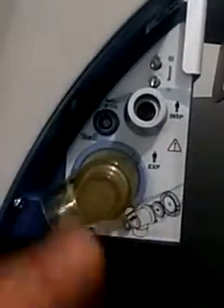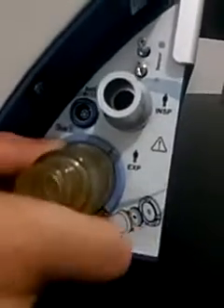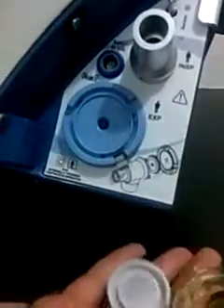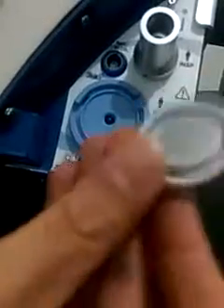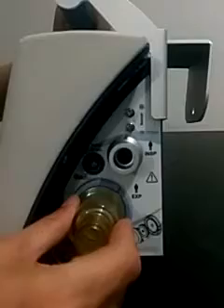How to disassemble the exhalation valve for sterilizing and to change or check the diaphragm: you just press the button here, then rotate the exhalation valve and take it out. This is the exhalation valve, and here is the magnetic diaphragm. You can check it. To assemble again, you just need to put the diaphragm in and then rotate to the right side. That's it.